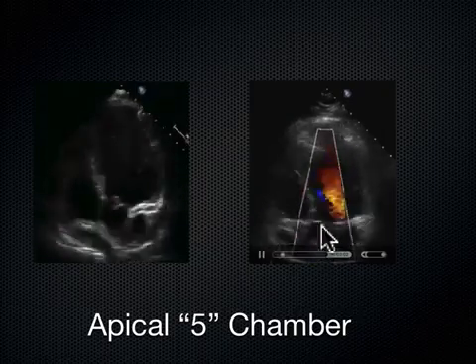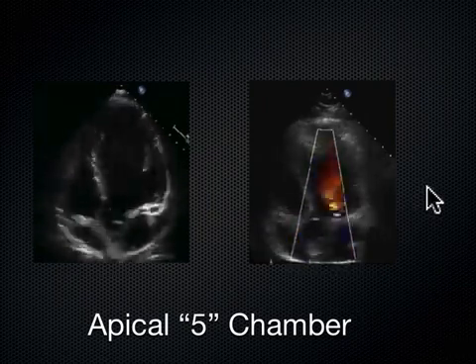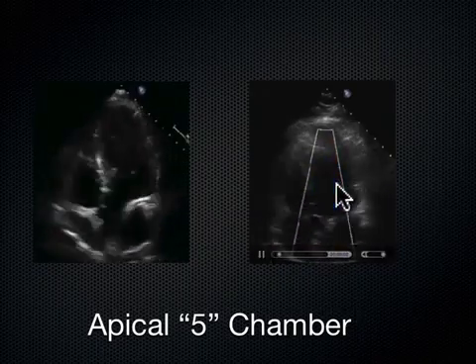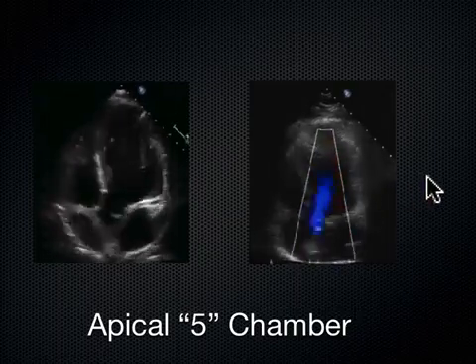If we get a red towards, well, then the blood is regurgitating back across that aortic valve and back into the left ventricle. So that's why there's a little aortic regurgitation coming out of the aortic valve. It's just right here. That's what that red is, red towards. So this person has some aortic regurgitation.